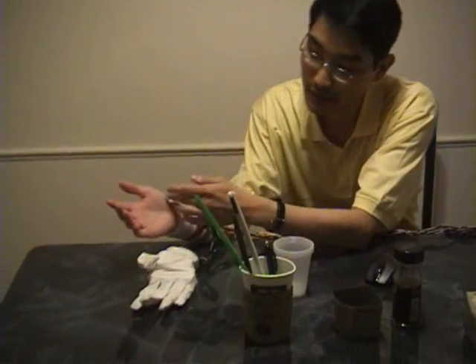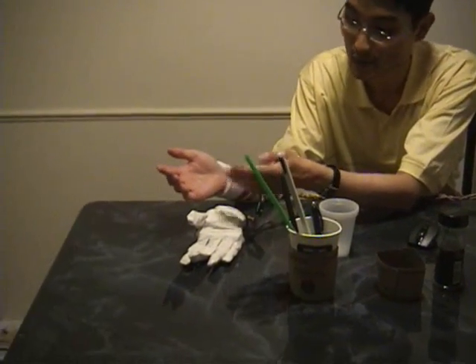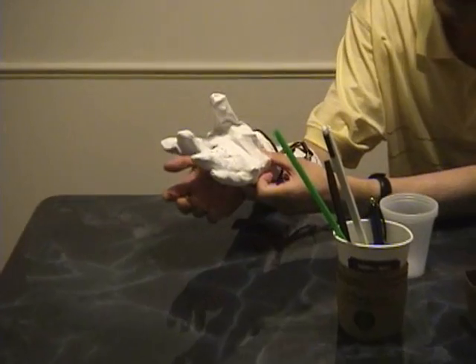Hi, for today's demo, I'm presenting the Mechanical Hand here. So basically, if you were to lose your hand during an accident or war, you would basically attach the hand to your wrist here.